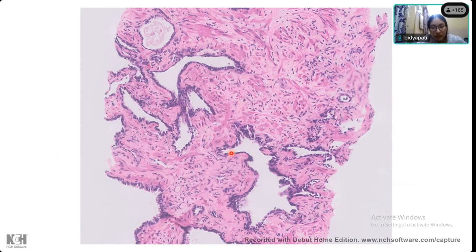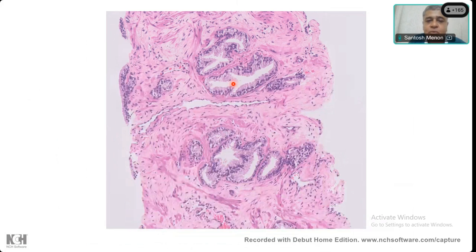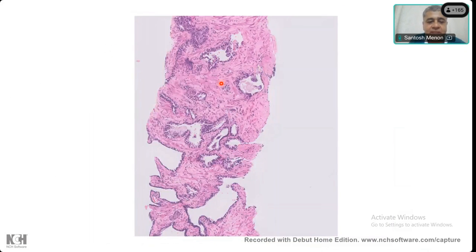Yes, sir. The luminal cells are almost atrophic in this. You see this? The luminal cells are not seen. What you see is very blue looking glands. And when you see these blue looking glands and stellate lumen, you're probably dealing with an atrophic kind of pattern. Although atrophic glands can be very small, they can be very rigid. But this is an early kind of atrophy where the luminal cells are not seen. Here you see the luminal cells are very nicely seen, and the lumen is very stellate. Again, is this benign or malignant? Can Vidya or Binaya comment on these glands?